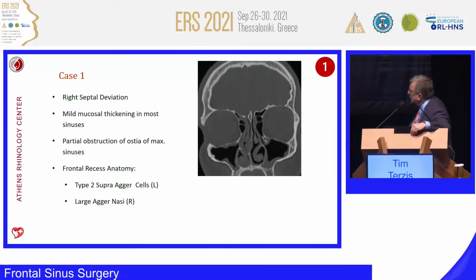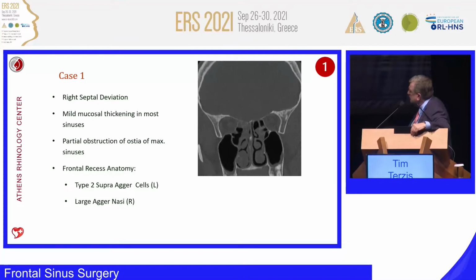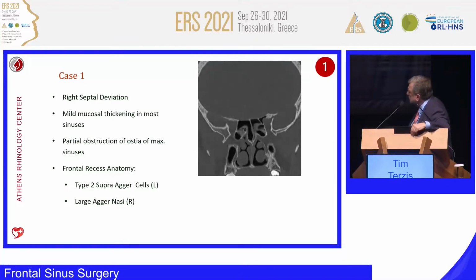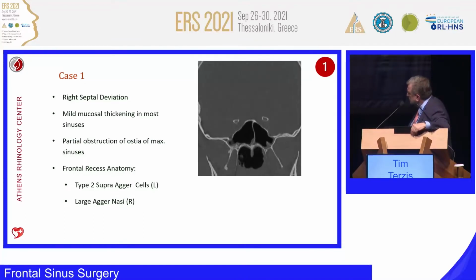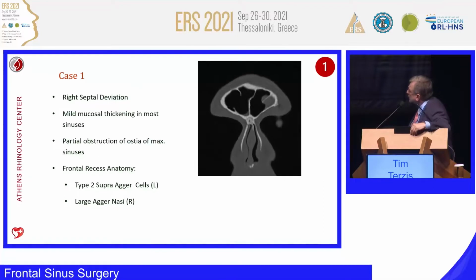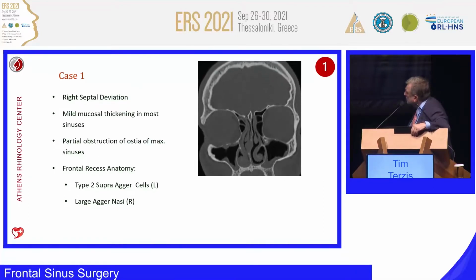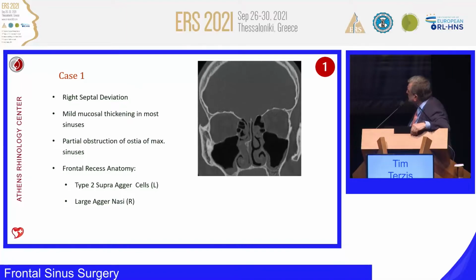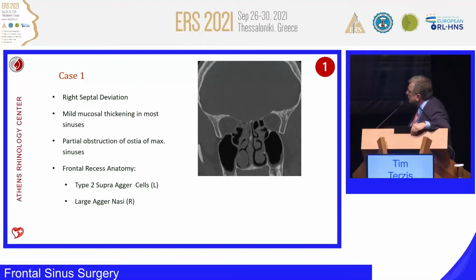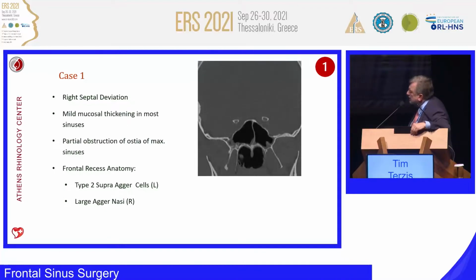And so probably I would like to do the surgery, as Andreas said, septoplasty and very delicate surgery of the ethmoid without resection of the mucosa. Yeah. Tim, just a comment. I would maybe go for endoscopic septoplasty, doing just a little incision and going for this. It depends how it looks when you make endoscopy.